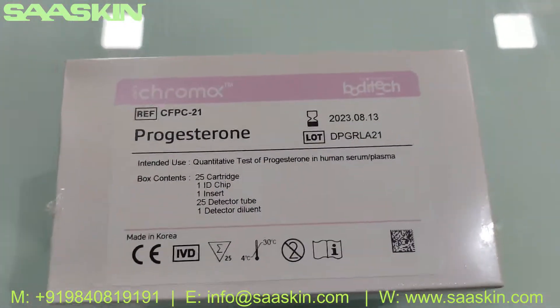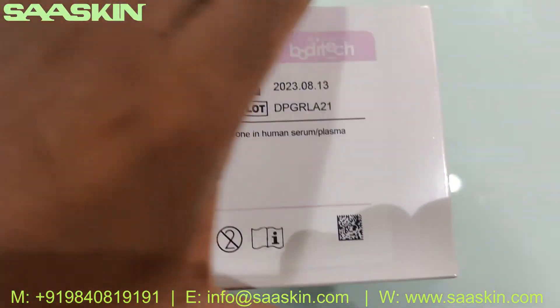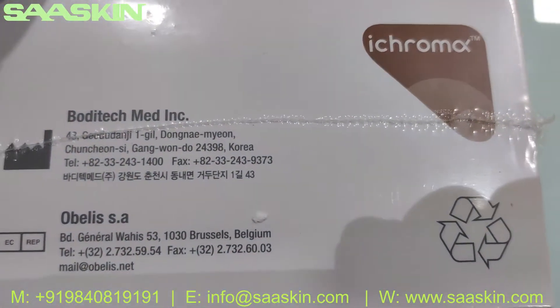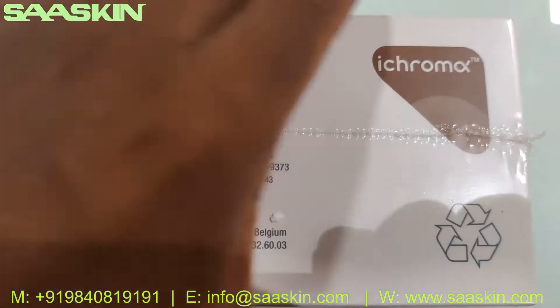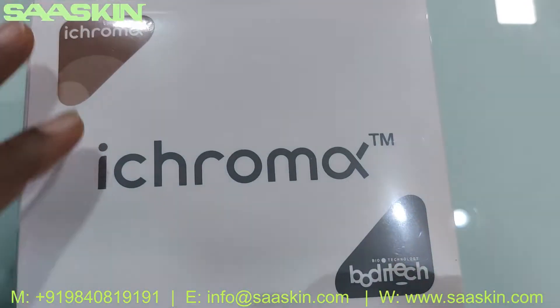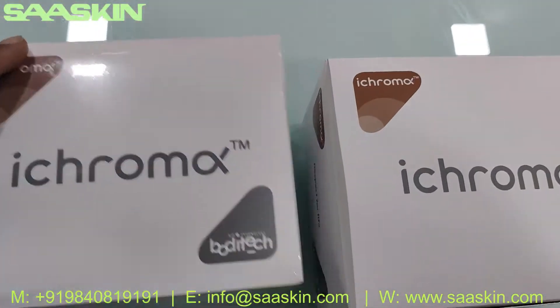This is how the box looks like — here is the top view, the front view, and the other side. It's manufactured in Korea.